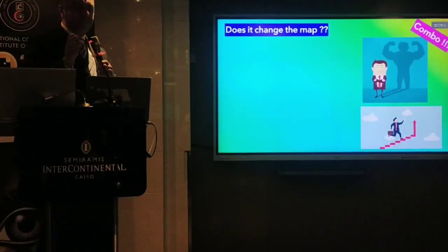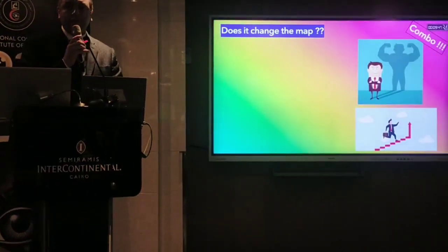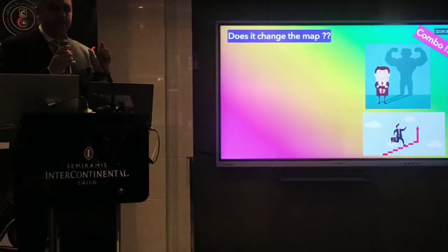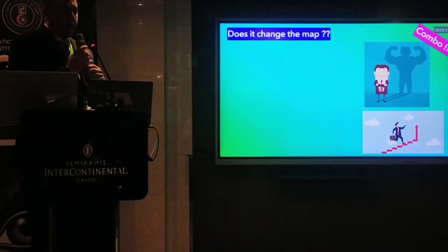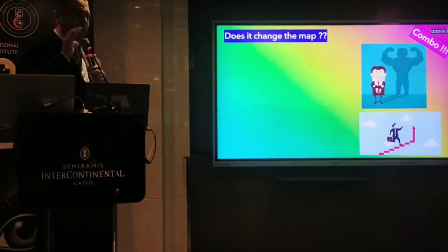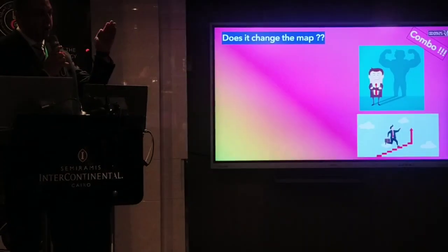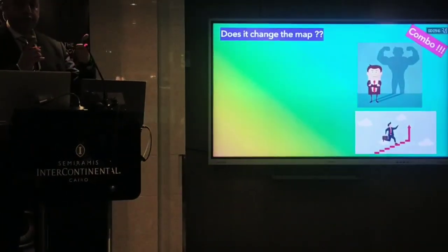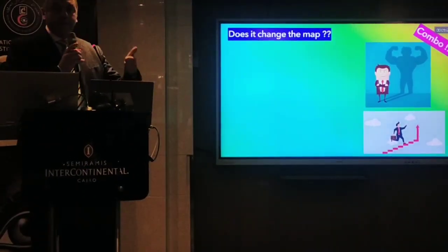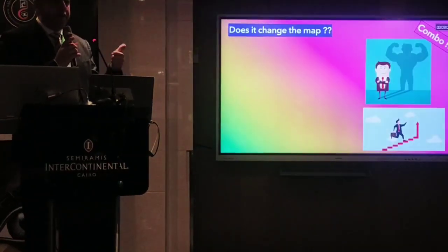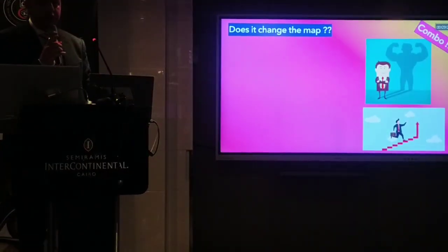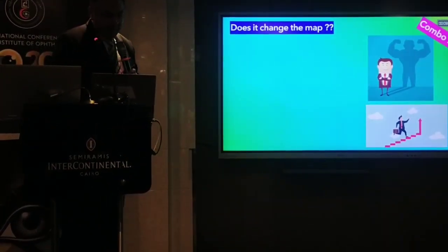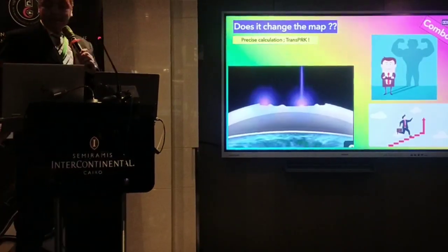The key is to feel comfortable with your decision about your case. If you have an epithelial map, you have to look carefully at the parameters and correlate all of them to the epithelial map. If there is significant thinning at the same point as the steepening of the anterior curvature, or suspicious points in the posterior curvature map — which is now more significant in diagnosis than posterior elevation — then you suspect the cornea. I rely on the back curvature more than the back elevation, believing that keratoconus is a posterior disease.